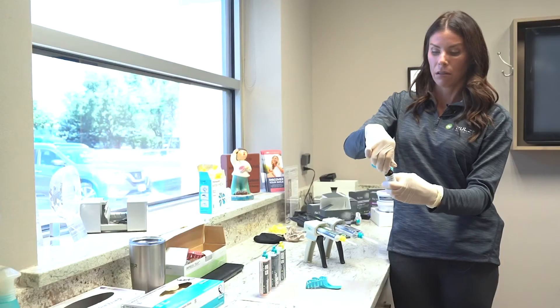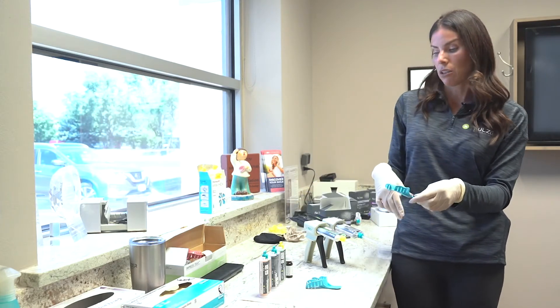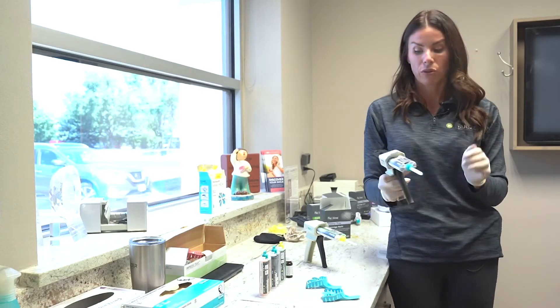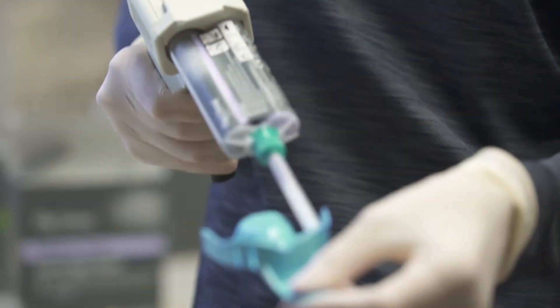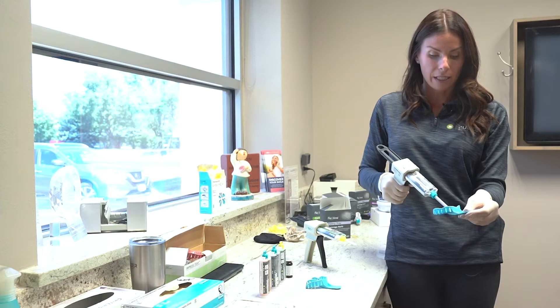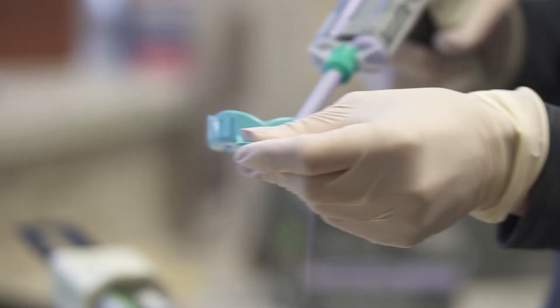Once that's painted on, allow the tray adhesive to set. Then we're ready for the assistant to syringe out the heavy body. As I start syringing the material inside the tray, I want to let you know the most common error.